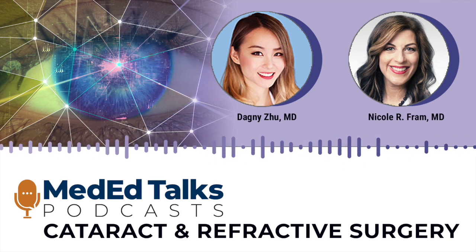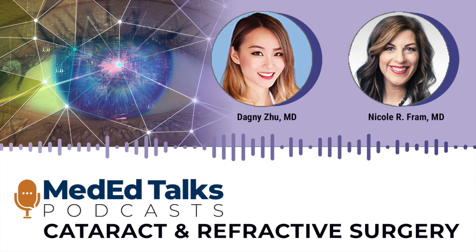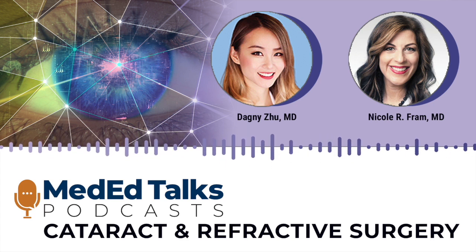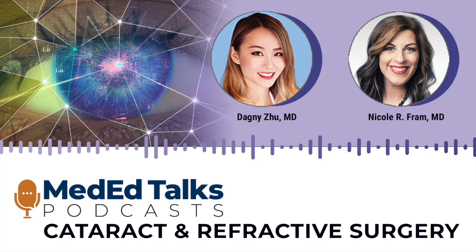The problem with intraoperative aberrometry is that if your cornea is dry or you're overhydrated, you could have some outcomes that were not ideal. But if you follow the guidance of how to use it, it was extremely helpful in our practice. In fact, we did it in almost every case because we could check our outcomes with the ORA analyzer. By using ORA and the analyzer, we could go back and say, how are we actually doing with these lenses and what's our outcome? It is particularly helpful in high torics and particularly helpful in post-LASIK. And I still use it in those circumstances.